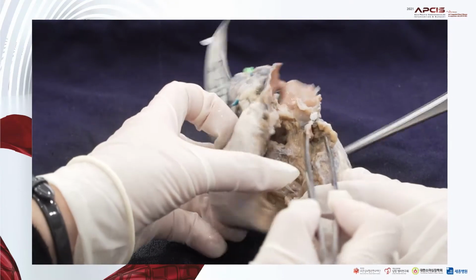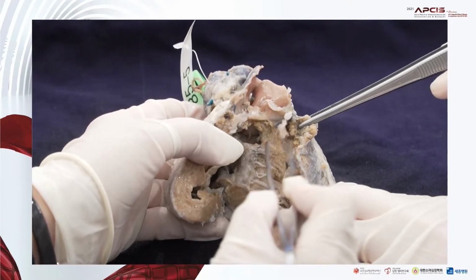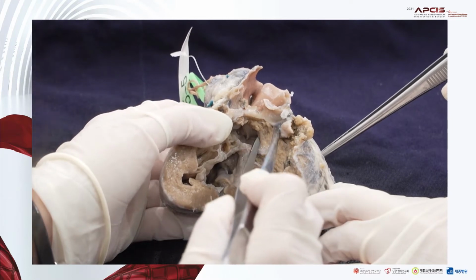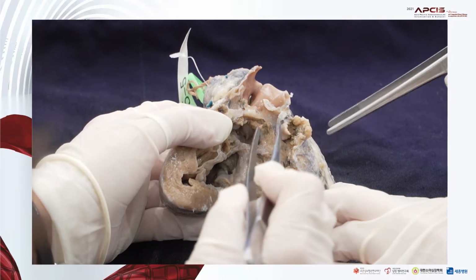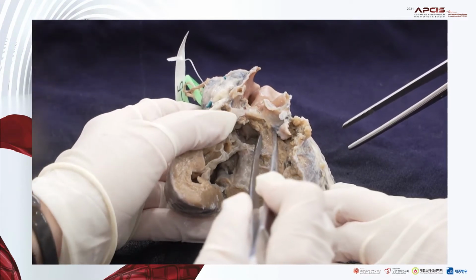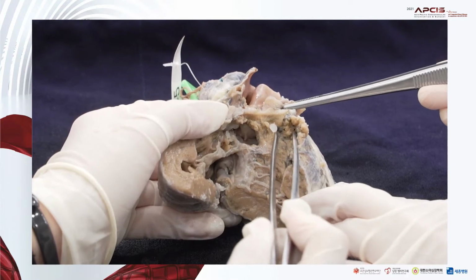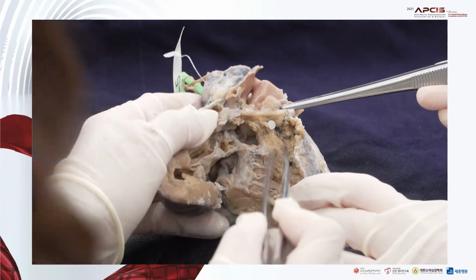And due to the previous operation of muscle removal, we cannot recognize a definite outlet septum, but the previous outlet septum should have been here like this. So the subpulmonic outflow, the original one, is only this portion, which is very stenotic.